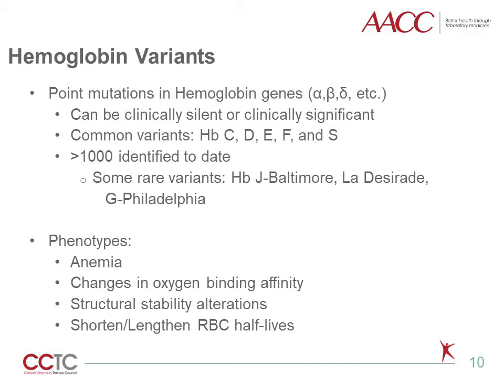However, resolving the peaks is only half the problem. It does not remove the effect these hemoglobin variants have on hemoglobin A1c in vivo. For example, if the hemoglobin variant is less stable, that will influence the RBC half-life and can influence the overall hemoglobin A1c. In the immunochemical, boronate, and enzymatic methods, we are also assuming that all of the hemoglobin variants glycate at the same rate as hemoglobin A, but we don't actually know that.